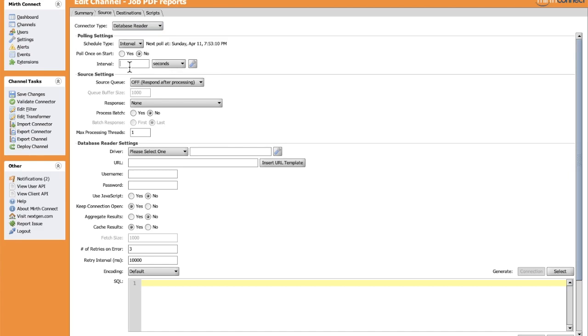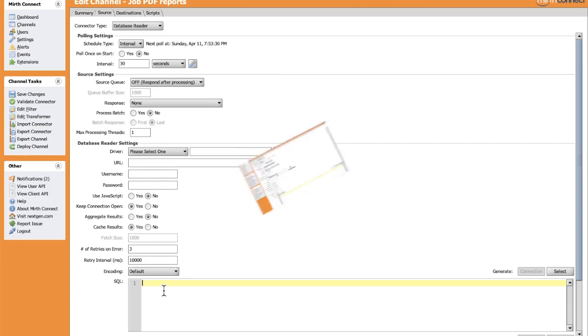We can change it, for example, to 30 seconds to allow this source to get records from the database every 30 seconds. The data included will be controlled here in the SQL body using WHERE clauses or other conditions.